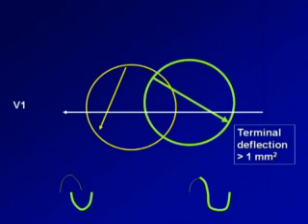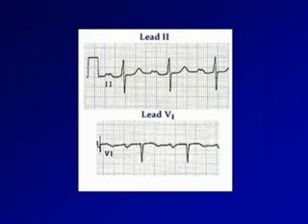When the left atrium depolarizes with increased EMF, looking from V1, remember it's heading away from V1, so we accentuate the terminal negative deflection. Our sine wave now grows deeper in the second half. You should be able to fit 1 square millimeter into that terminal negative deflection. It's the most overcalled finding in electrocardiography because normal people can have the sine wave appearance, so you want it deep enough to fit a square millimeter, or one of the tiny square boxes, into that terminal negative deflection.